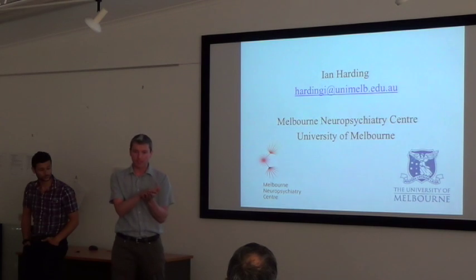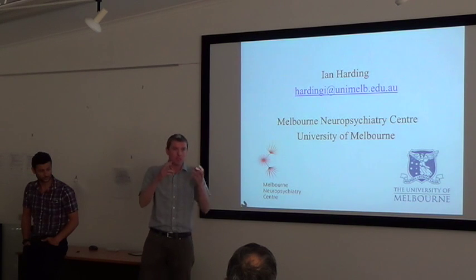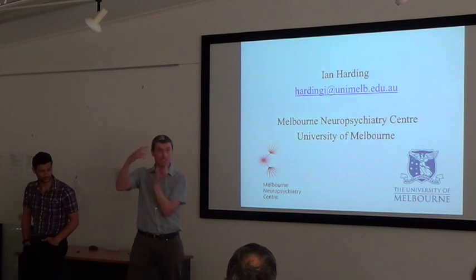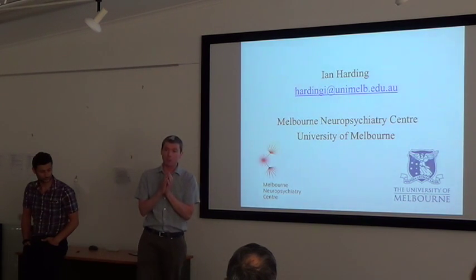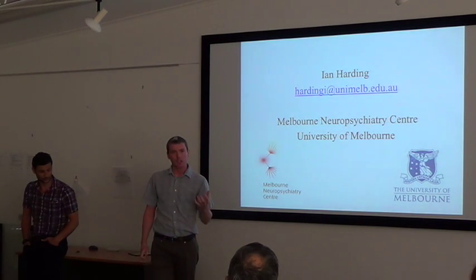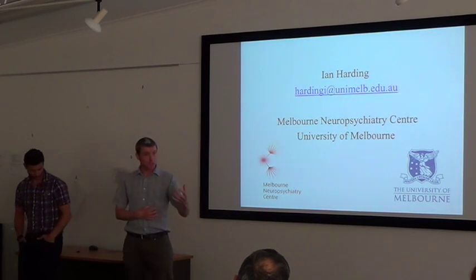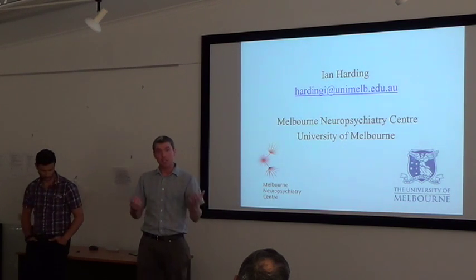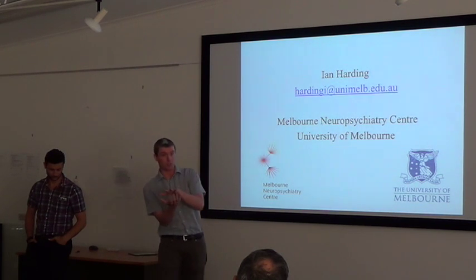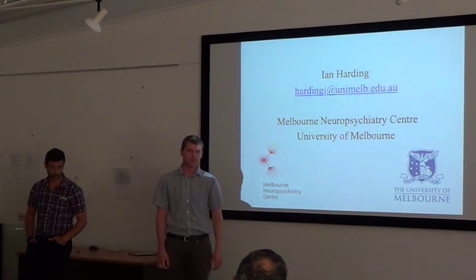The other thing that's important is, of course, people have different sized brains. The brains are in different space, we like to call it in the field, and so we need to map them all into the same space. We can do that with the fMRI images, but they're of very low resolution, and we don't get a very good overlap. So we often use these high spatial resolution structural images to register all the brains together, and then we can overlay the function on top of that, or apply the same transformations to the function, so that we can then do group level studies.